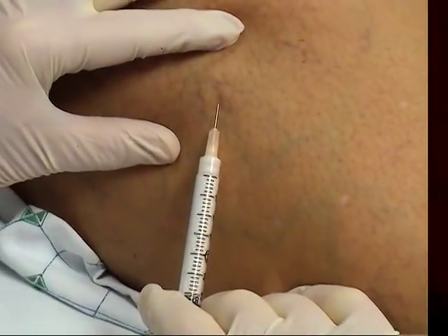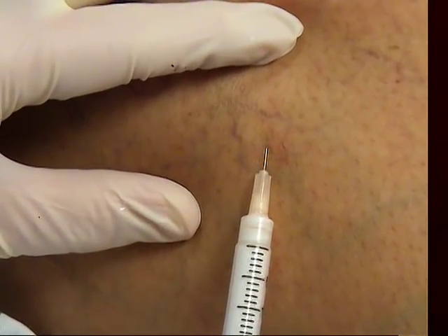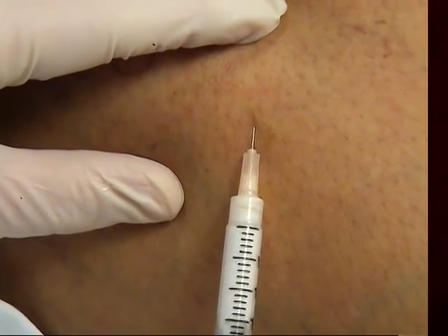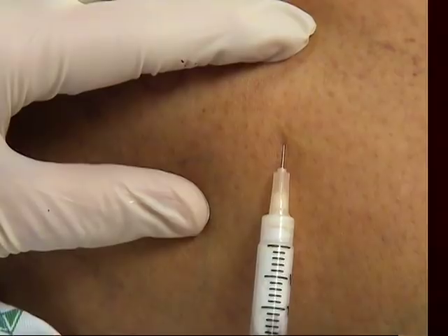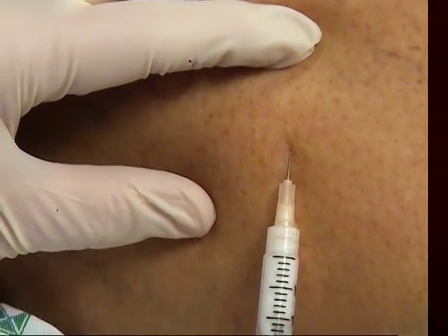A little needle here — keep very still, one more. Into that. And there it is. Foam technique again for these vessels that are about 2mm in diameter. I think you can see immediately they've disappeared very nicely. One question is how much do you have to put in and how long do they need to be foamed? I think 15–20 seconds is probably enough.